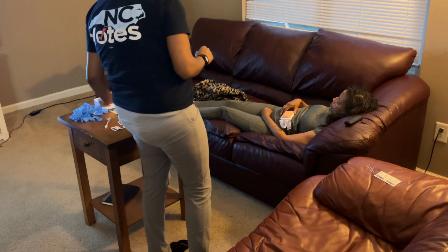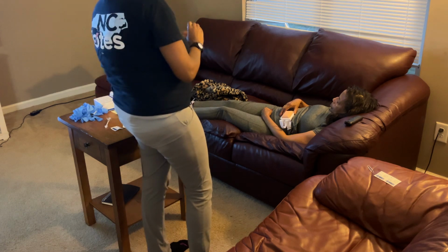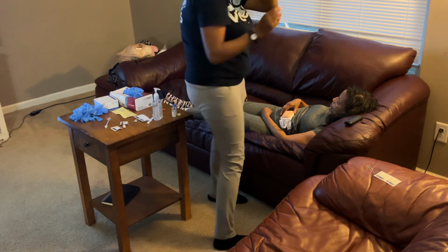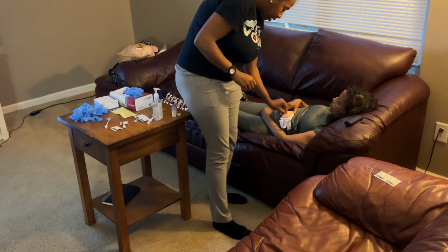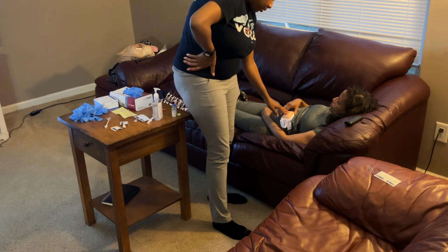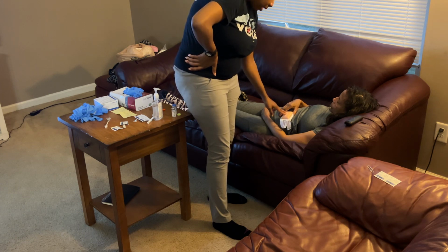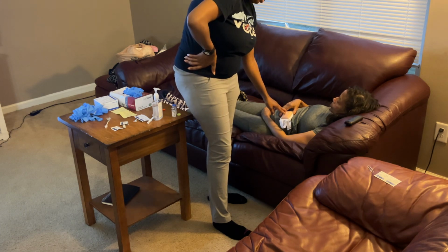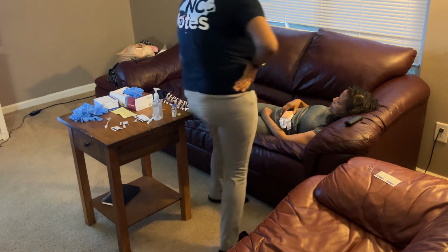Now I am getting another alcohol swab. I am holding it down. And the first time I did move it in circular motion. At least I think I did. All right.